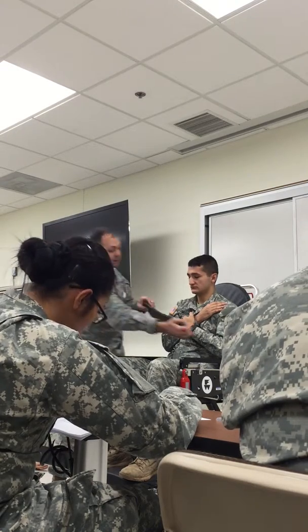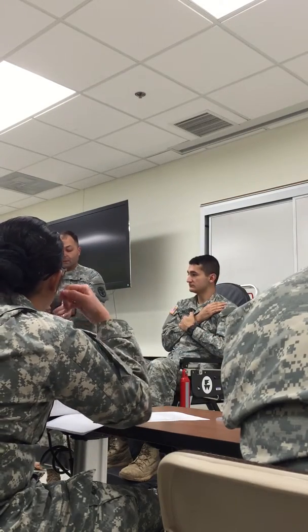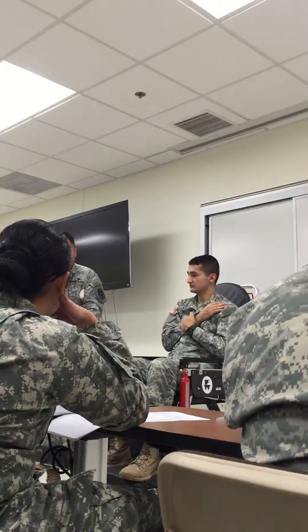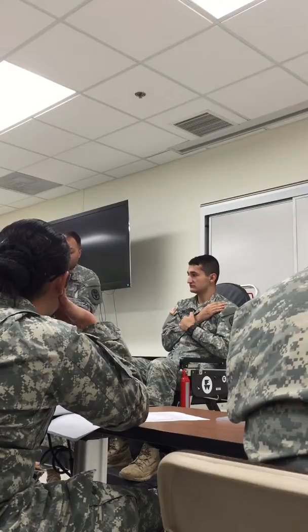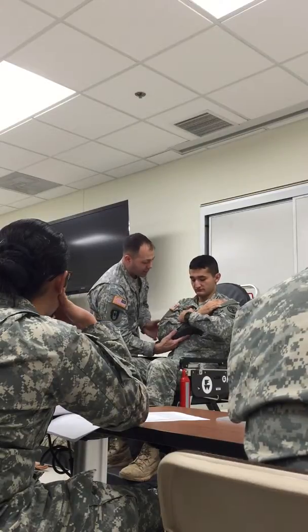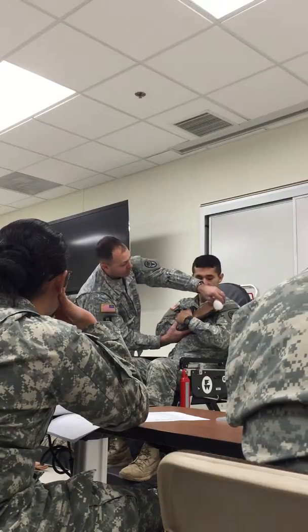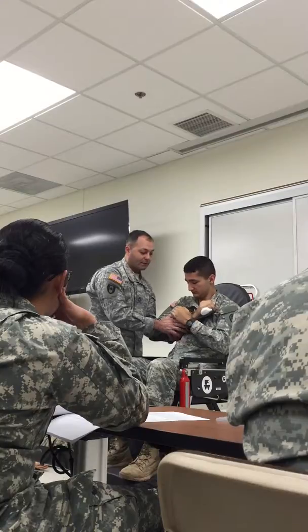I'm going to take this. I'm going to measure my SAM splint. I'm going to come up his elbow just a little bit, and I'm going to mold my splint. There we go. All right, buddy. What I want you to do is lift this hand up just a little bit. I'm going to slide this underneath your hand and under this. There we go, just like that. And I'm going to take this. I want you to grab this in your hand. Perfect. All right. Now at this time, I have your arm.